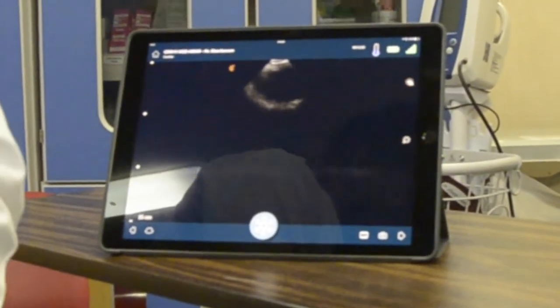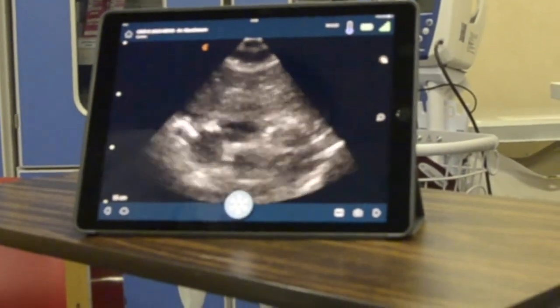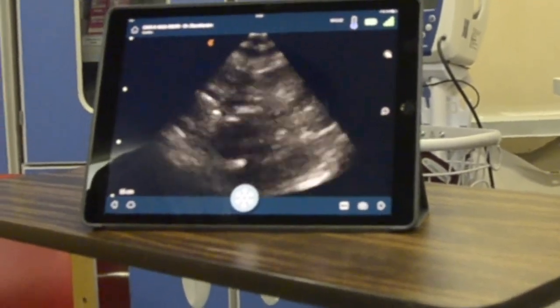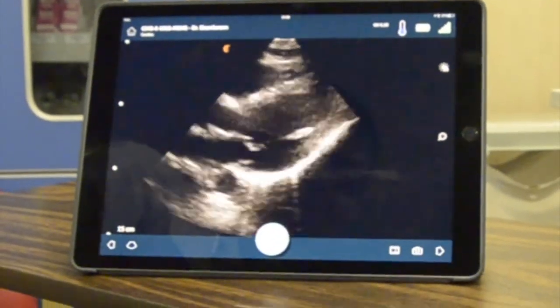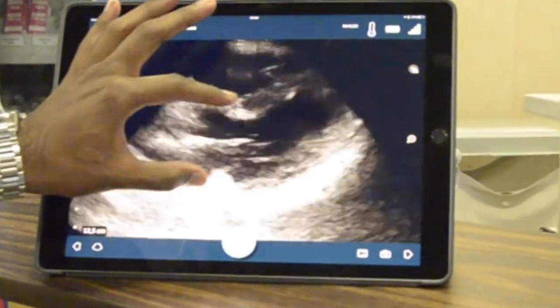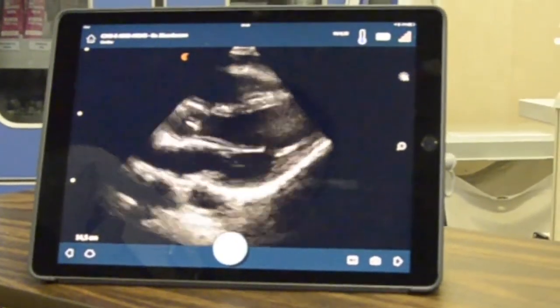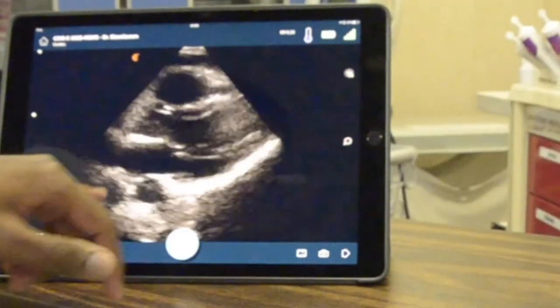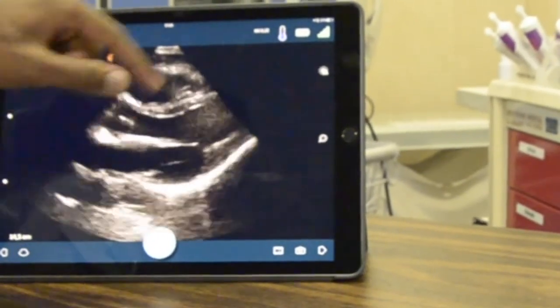Let's see if we can get a subxiphoid view. This is a simulated phased array so it's not the best, but that's a beautiful view. We can decrease the depth, increase it — there are your valves, and that's the thoracic aorta behind that. So you can see if there's fluid behind — there's a pericardial effusion.